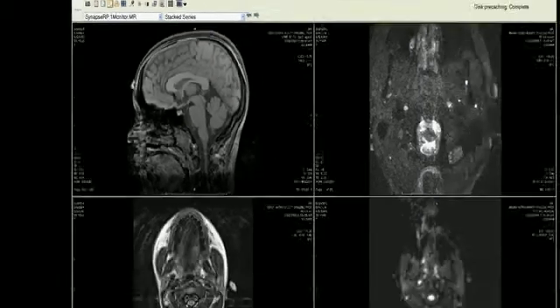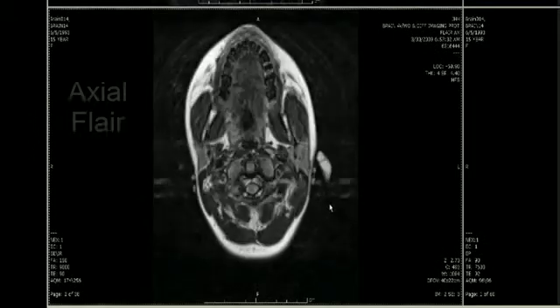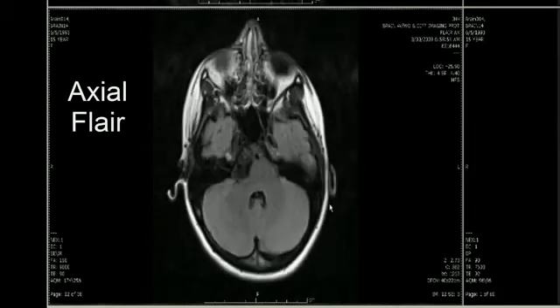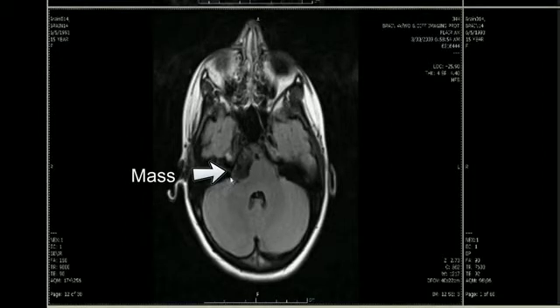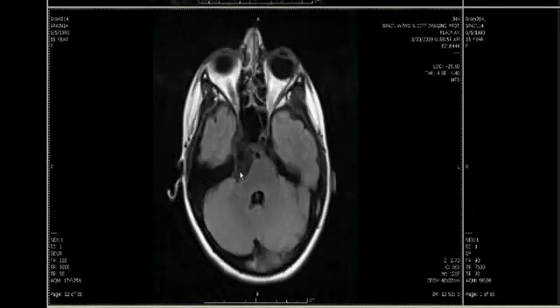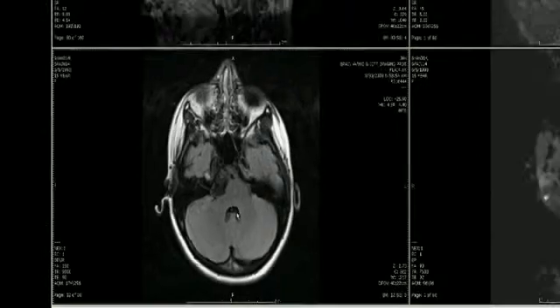We next go to the FLAIR scan, and scrolling through the axial scans, we see a mass which is to the right of the pons and extending to the cerebellopontine angle cistern. It has low signal intensity, but not exactly the same signal intensity as the cerebrospinal fluid.